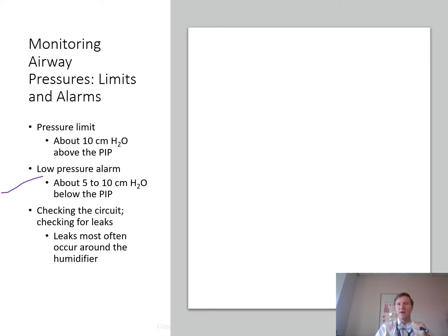Note that the waveform causes the line to drop to baseline before another breath is delivered, right? Do you see that here? It drops to baseline. There we go, I just circled it, before the next breath is delivered. So that's something to pay attention to. Is this a chest tube leak, right? That's a great way, especially if you've ruled out everything else. But that system leak can be pretty significant. It can be frustrating, but make sure that the patient is safely ventilated and oxygenated during this whole thing.